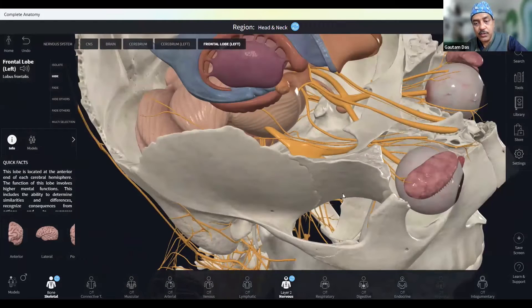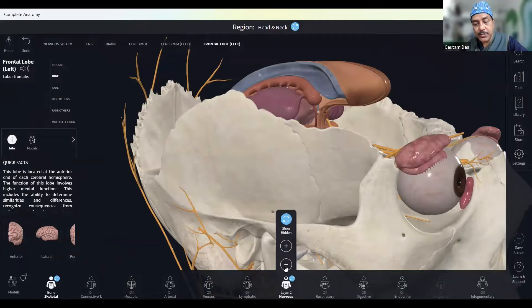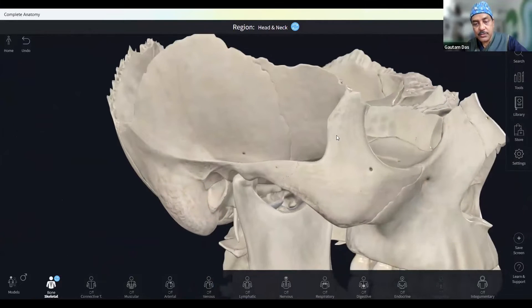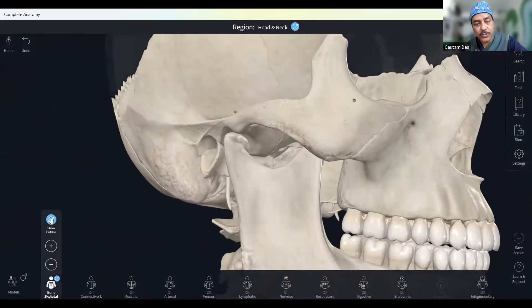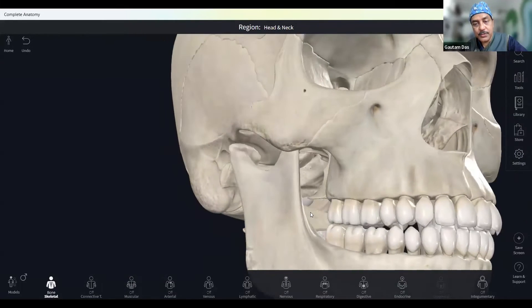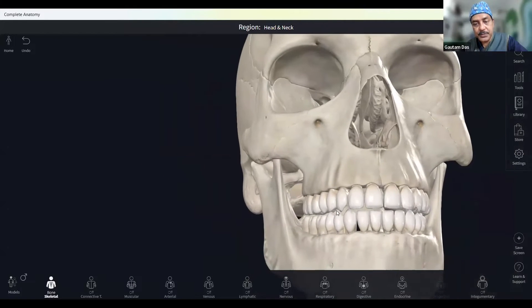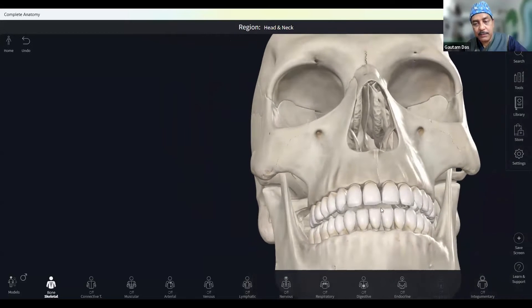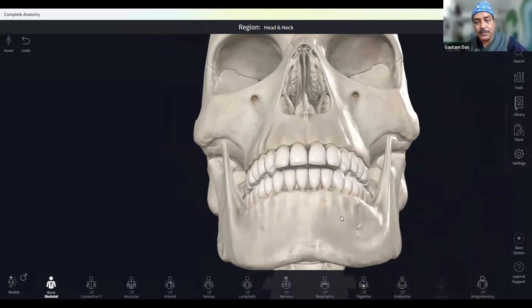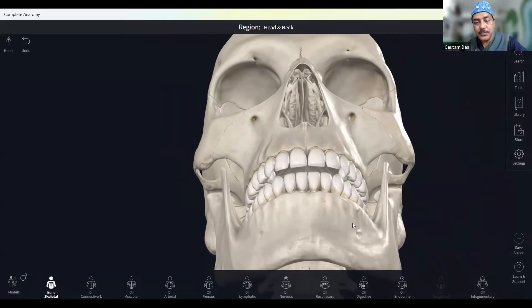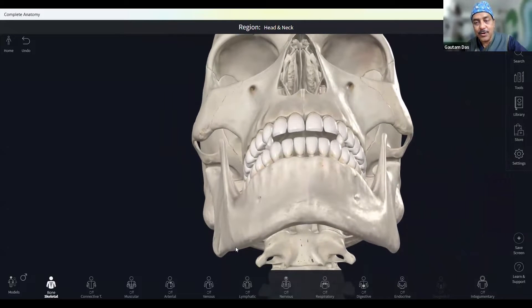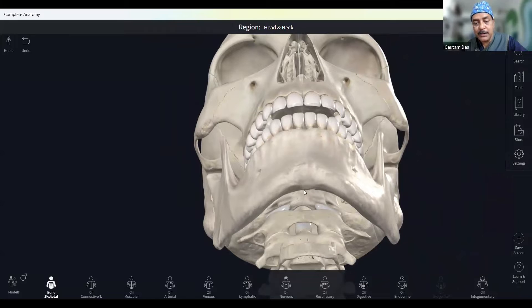You have to enter the foramen ovale from below. The foramen ovale is in the base of the skull, so you cannot see it on a true AP image. To see the base of the skull, you have to look from the caudal end — tilt your C-arm caudally so that you can see the mandible as an inverted V.